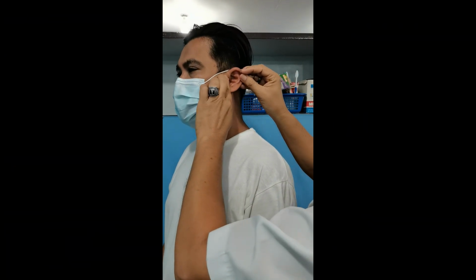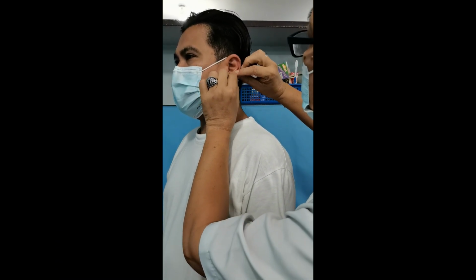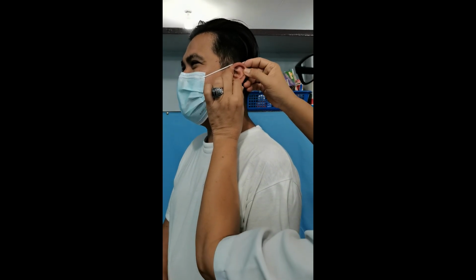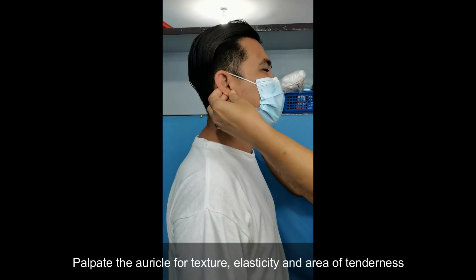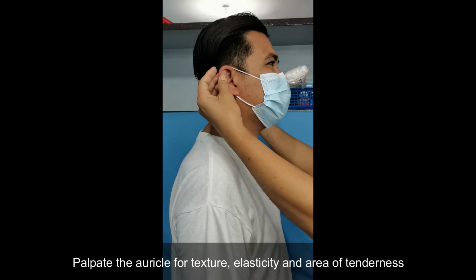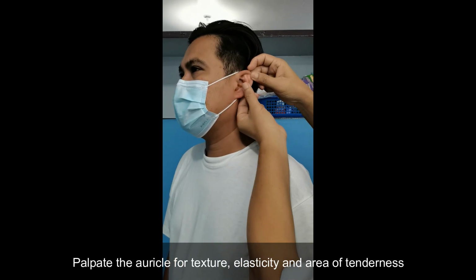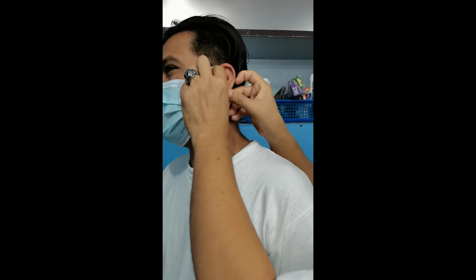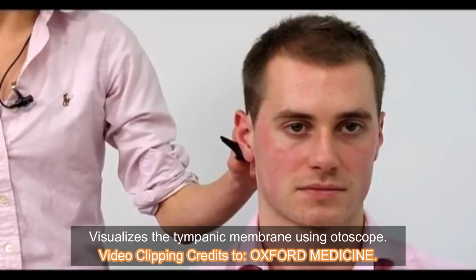Inspect the auricle, color, symmetry, size, and position. Palpate the auricle for texture, elasticity, and area of tenderness. Visualizes the tympanic membrane using otoscope.